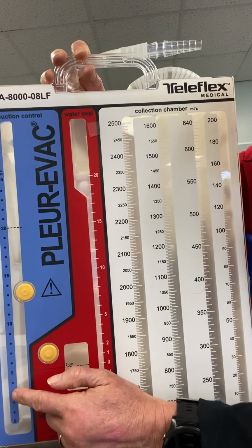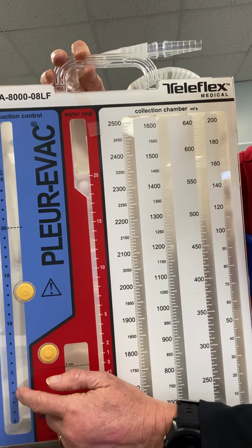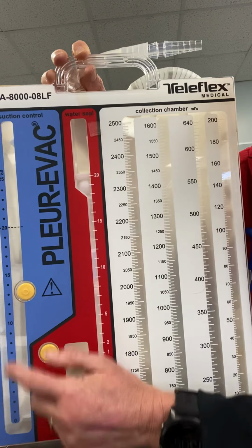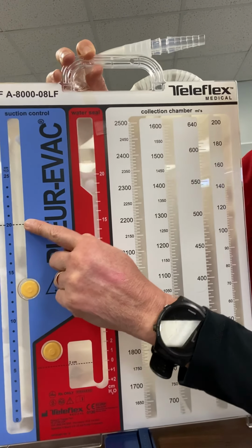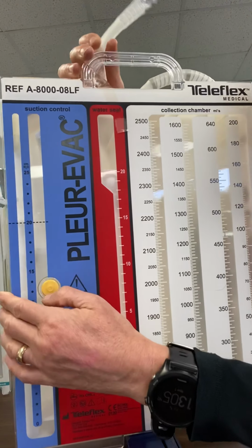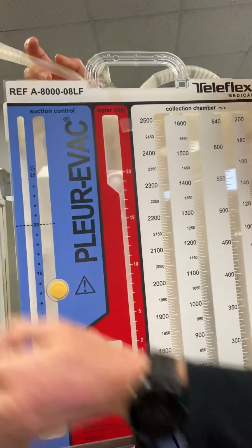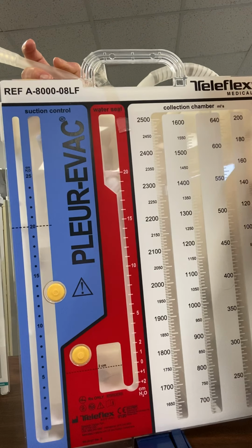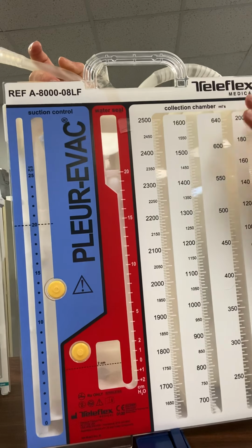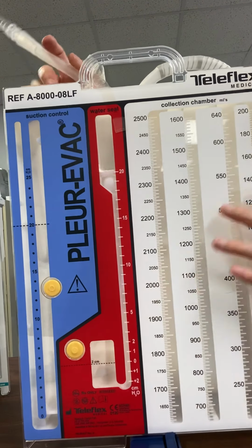Now this third chamber, remember, this is the suction control chamber, sometimes referred to as the water suction control chamber. This is a wet system. So this would be filled up to 20 centimeters of water. Right here is that line. And then this tube goes to that chamber. You would hook this up to low wall suction so that this has gentle bubbling in it. And that's basically the principle of this.